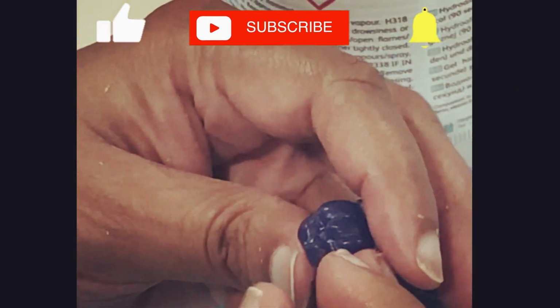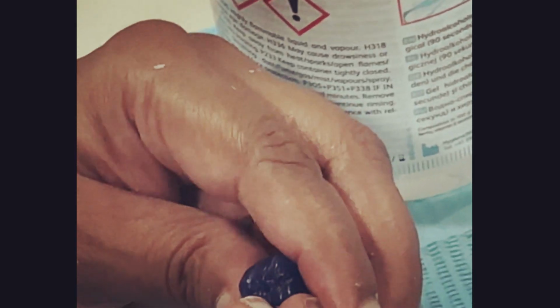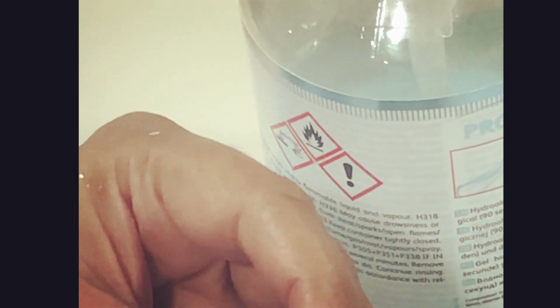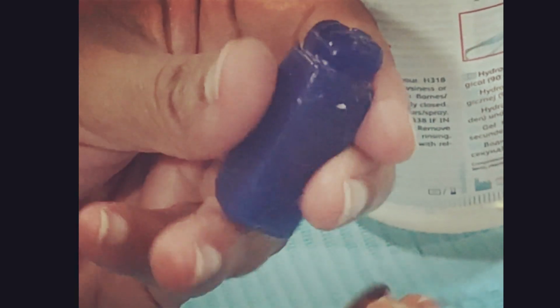So I'm just going to finish it a little bit more. So remove all this wax debris which is there on the occlusal surface to make it neater. Then I want to look at the height of the cusps. I'm happy with the lingual. Even buccal I'm happy because it's slightly shorter than the lingual. And maybe a bit of shape I want to give for the buccal, so I'm just going to run my carver like that.